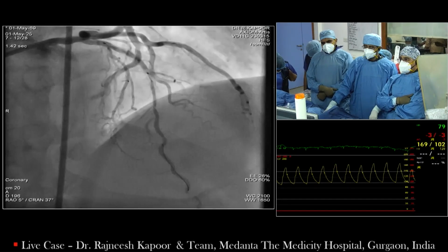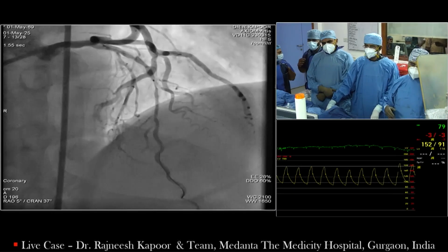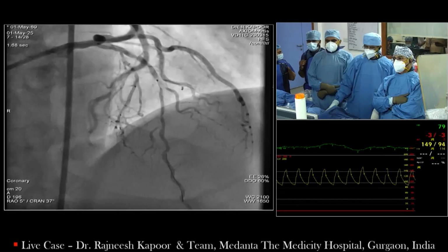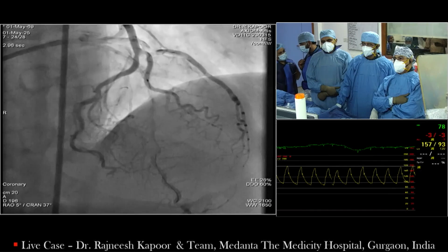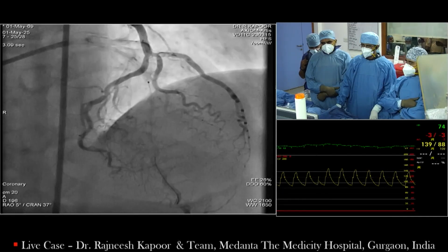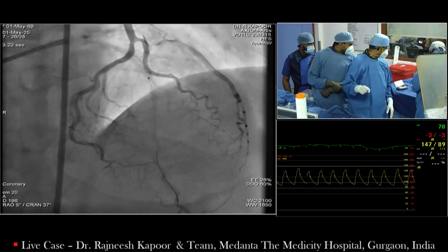But again, I would want to know the LVEDP since we're going to be doing rotational atherectomy, just to know your baseline in terms of starting. Again, your runs here would be slow and meticulous, give the patient a chance to breathe. I think those are very important elements of this. The other comment about ballooning is that in many cases, before we had atherectomy and you ballooned these lesions, you'd get a significant dissection. And so by doing atherectomy prior to ballooning, you can hopefully minimize that potential. Yeah, with that much calcification, I will definitely go up front with atherectomy before doing anything.